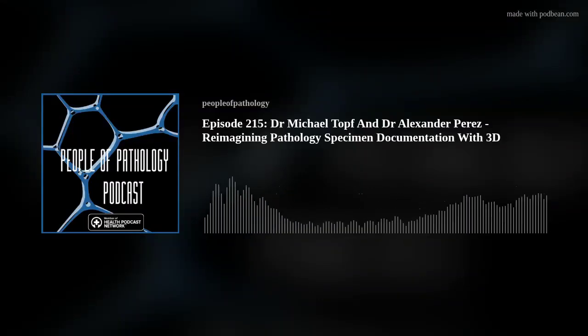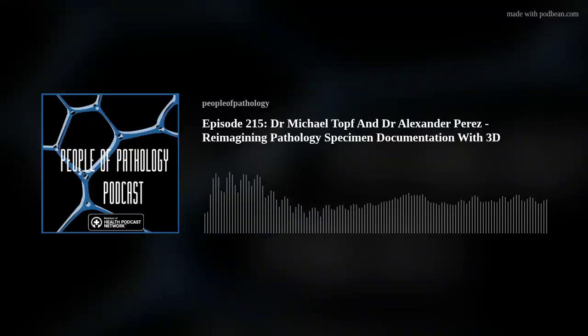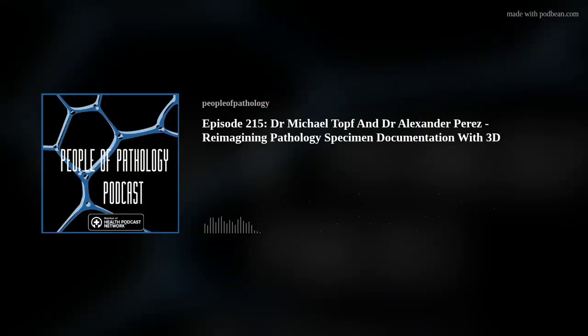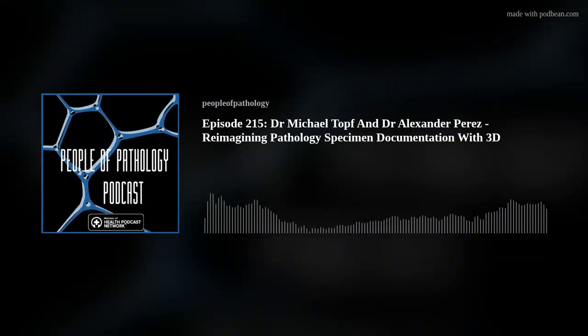Now, in this instance, these scans are even at their biggest, like a couple hundred megabytes. So you can pretty easily just store these for a much longer period of time. Even if a patient has a recurrence 2 months or 2 years down the road, you could easily recall that specimen and have the original specimen, the original path slides, the original report and everything for review, as opposed to the current situation, where the specimens unfortunately just have to be discarded after a certain period of time. So you have this durable representation of the specimen, which you can use for really a variety of purposes.